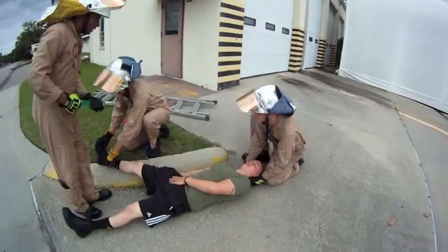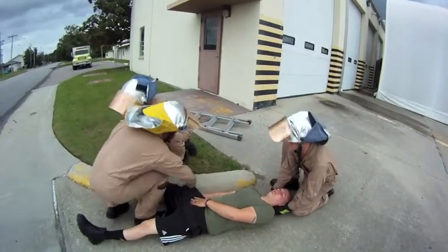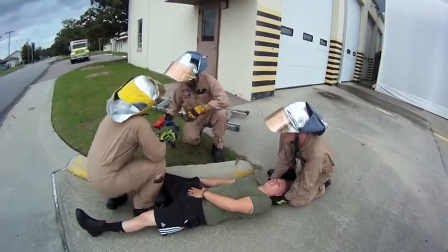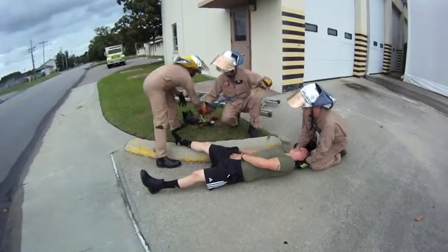Simulating cutting up the boot. So we're going to put this traction splint on your leg. It's going to relieve the pressure. It's going to make you feel better. Okay. In the meantime, it's going to hurt maybe a little bit. So if it does or anything, let me know how you feel.